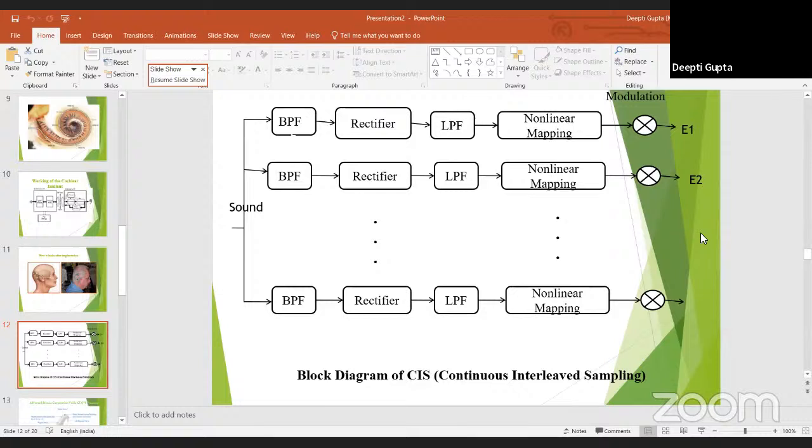So it will function like that. But now you are thinking that if all the frequencies are coming at the same time, then they will overlap and interfere with the signal. Then the signal will convert into noise because many signals are coming simultaneously, so it will seem like noise. So no, it's not like that. It is not continuous. It will go one by one.